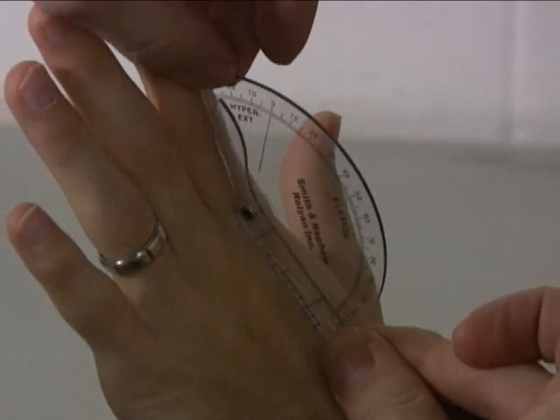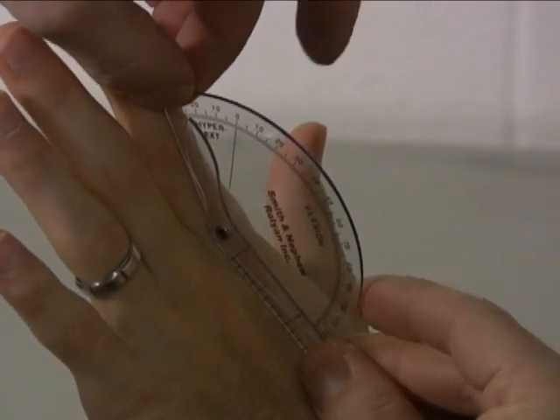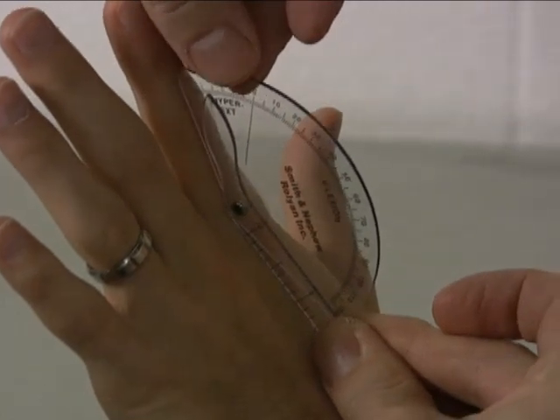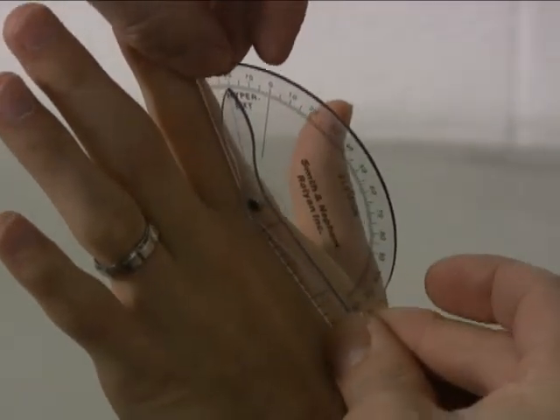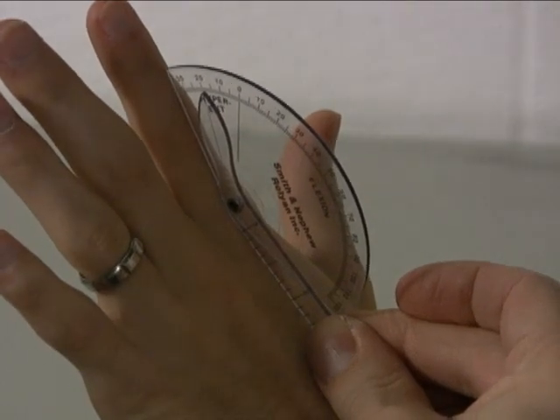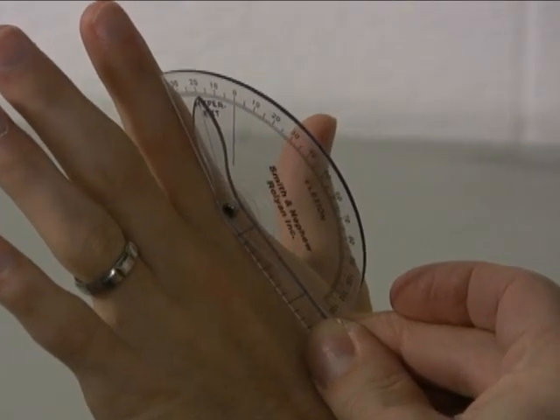Very good. And so that is your initial measurement or extension measurement. In this case, we have about 18, 19 degrees of hyperextension.